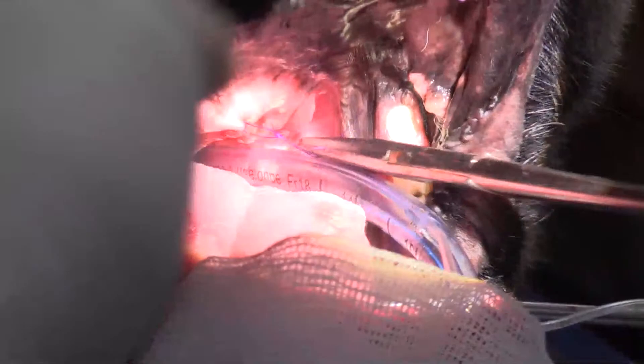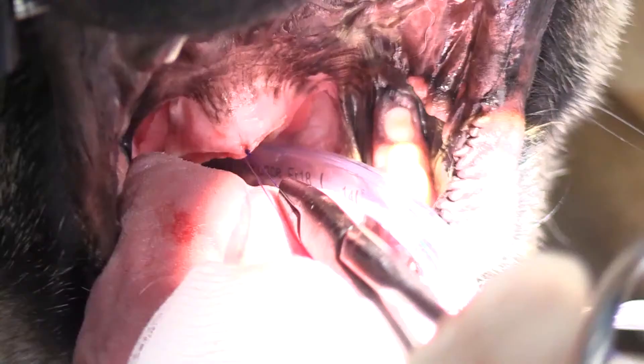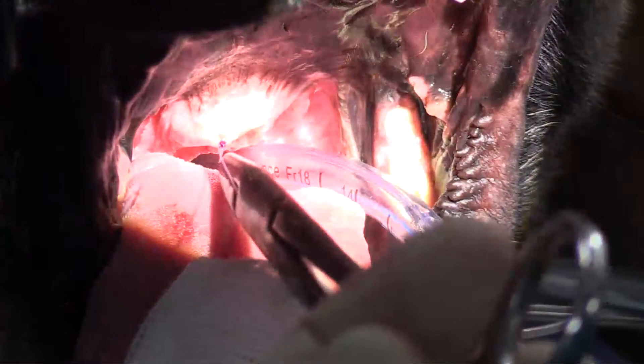In human surgery, ENT surgery, with kids that are having tonsillectomies, the amount of pain using coblation is significantly less than what you see with conventional electrocautery or even conventional cold knife surgery. The coblation unit, in contrast to ligature, is actually not expensive at all.